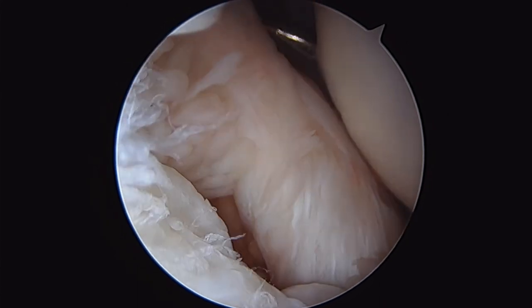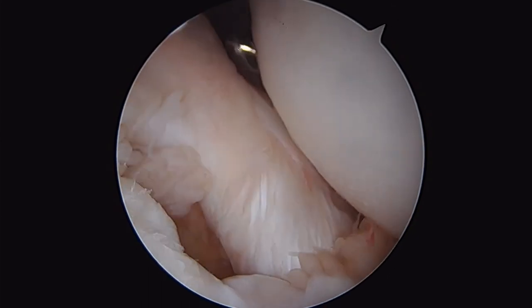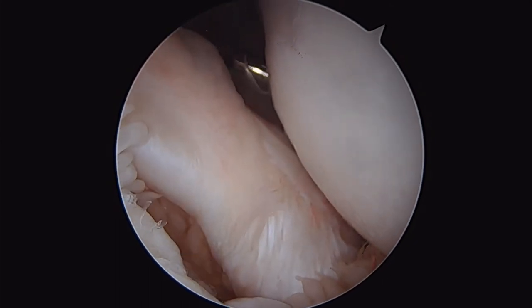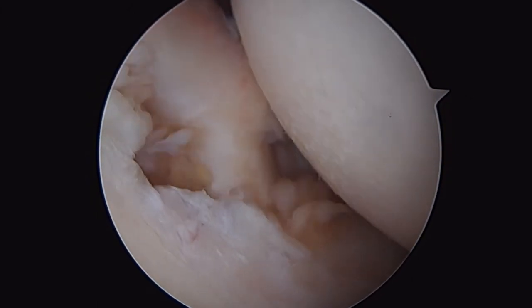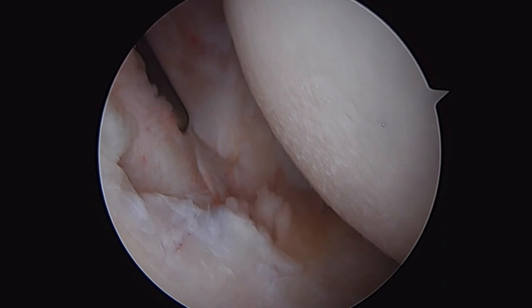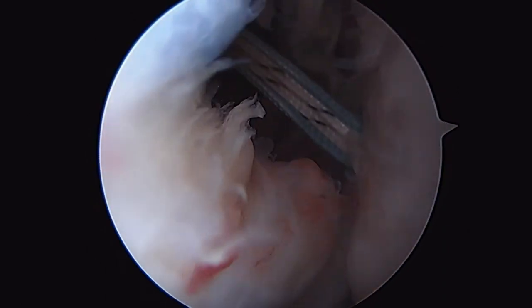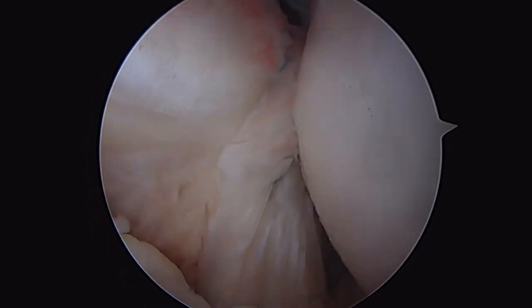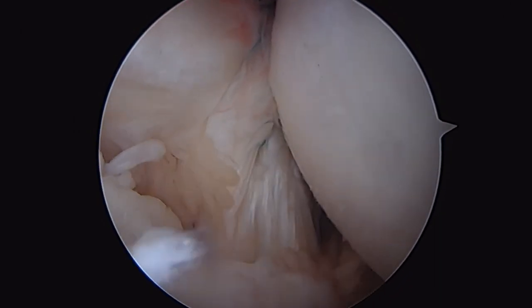This is arthroscopic footage of a subscapularis repair I performed. With my grasper I am pulling the torn and retracted subscapularis back to the humeral head. You can see the piece of tissue to the left of the screen represents the comma tissue. I am showing how with mobilization I can now bring the torn and retracted subscapularis back to the humeral head. This is my completed repair — as you can see the sutures coming out of the anchor which have secured the subscapularis back to the humerus and have secured the medial sling back to the superior lateral portion of the humerus.